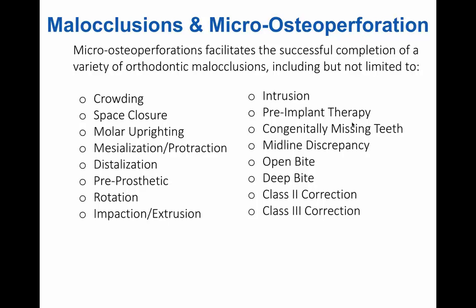I'm not going to read all these to you, but obviously any type of tooth movement that you desire can be performed with any of these tooth movements can be accelerated with micro-osteoperforation, because the principles of bone remodeling are the same no matter what kind of movement you're performing. So whenever we can accelerate that bone activity, we can enhance the speed at which we can perform all of these procedures.